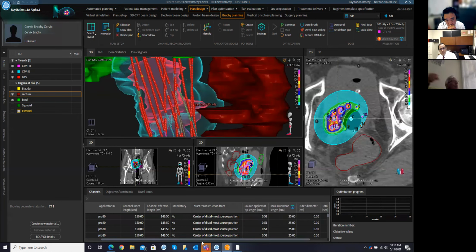Thank you. So just a follow up from Bruce's question, you don't have it set up to avoid an error, so that once the system arrives at the institution, it's set up as a, quote unquote, variant system per se. That way people don't make the mistake with that typical first dwell point. Or can that error be committed basically?